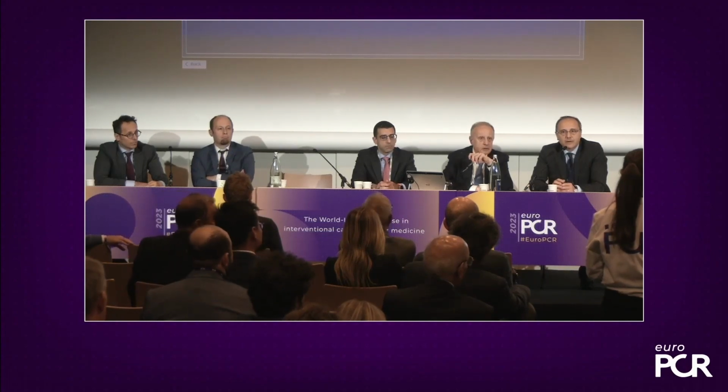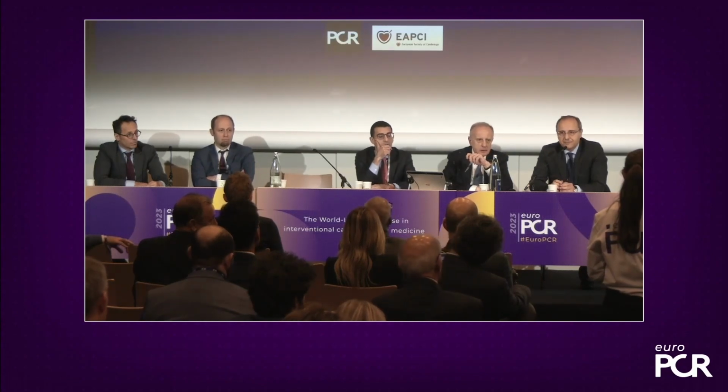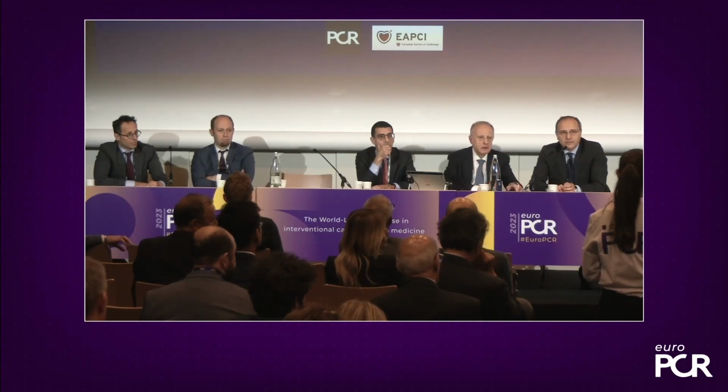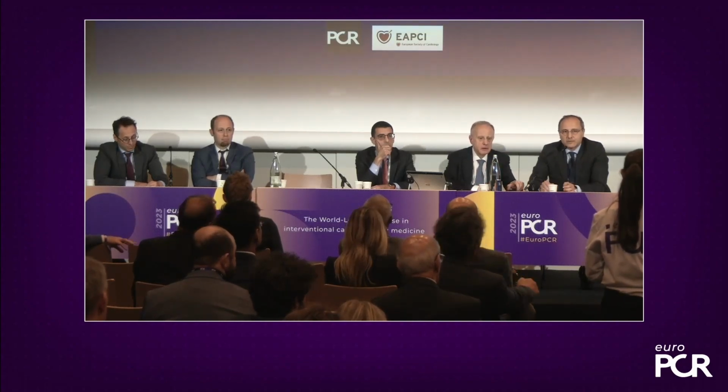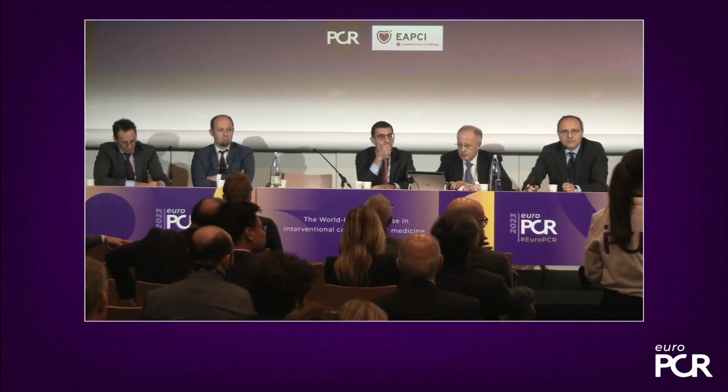And also, something that we have to remember, that very long stented segments tend to be underexpanded almost by law. And that is easily elucidated by post-PCI, good quality pullback. And that's the easiest thing to correct with high pressure balloon. So I think, if you're there with a wire, why not use it? Why not use it?